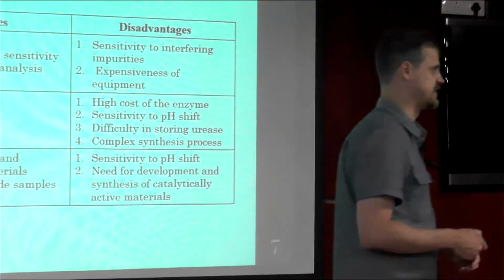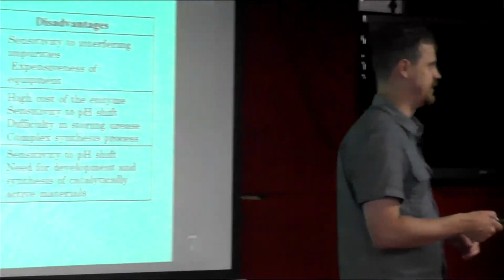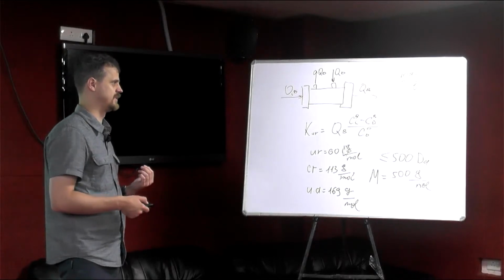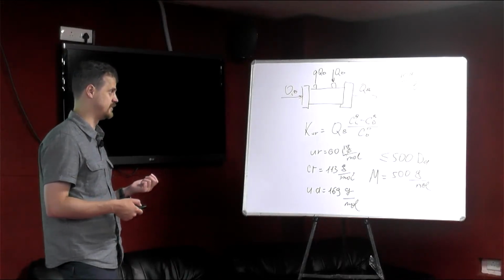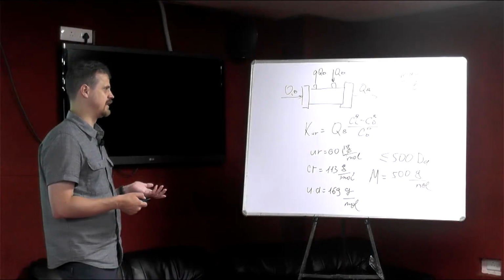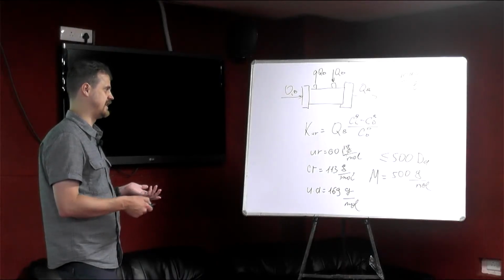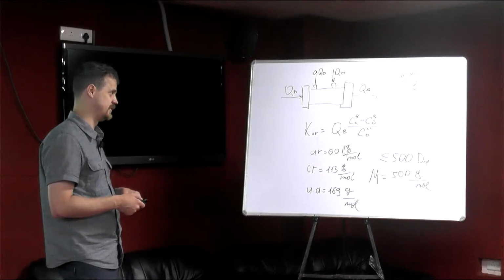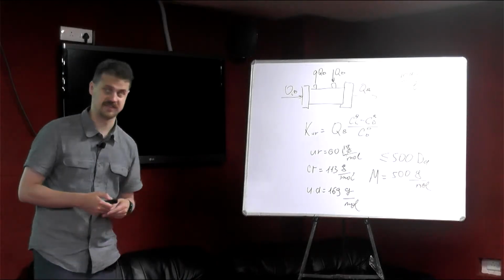Nevertheless, if we have the opportunity to monitor one of those parameters, and if we know that urea, for instance, is a small size molecule, some parameter that we describe as the small size molecule, then we basically are confident that other toxins will be removed from the system as well by the same means.